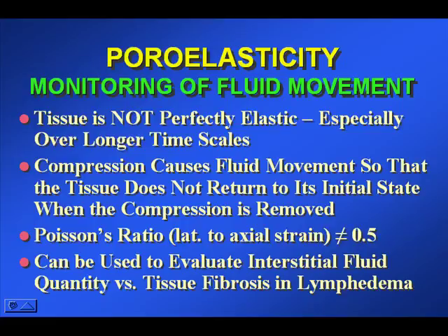We hope that this parameter can be used to help evaluate and quantify the amount of fibrosis that is present in tissues with edema versus the amount of actual fluid. MR can be used to evaluate fluid directly, but again, it's very expensive.